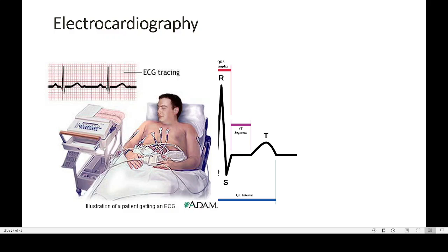So here we have to study about what is electrocardiography, otherwise known by the name ECG. Here that's a clear idea of what ECG is meaning. Now most of the time you might have seen a graph like this, maybe in your school textbooks, and that is an ECG graph.